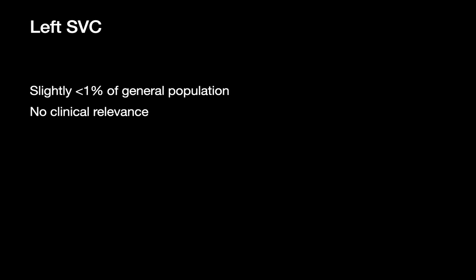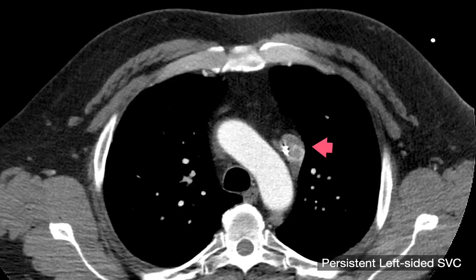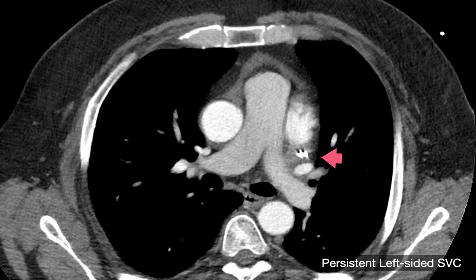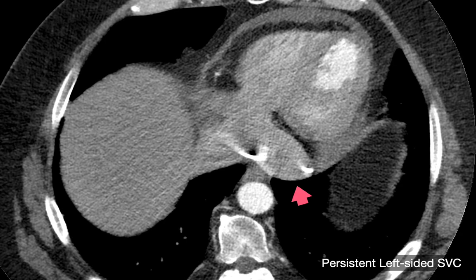A small portion of the population has a non-duplicated left-sided SVC. On chest x-ray alone you cannot necessarily exclude a duplicated SVC, but CTs are diagnostic — you'll see no SVC on the right side, and the left-sided SVC will be larger than in a duplicated SVC patient, since all blood is returning from the upper body via this left-sided pathway. The coronary sinus is also noticeably larger compared to the duplicated SVC example.